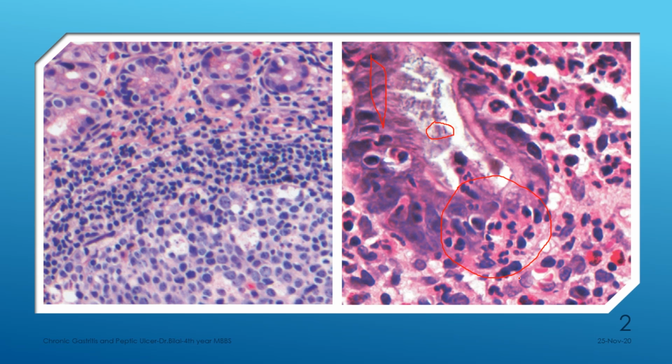You can see neutrophils, the polymorphs, you can see few lymphocytes as well. In this area you can see some eosinophils as well. So inflammatory cells in this photomicrograph are seen invading into the surface epithelium. Few organisms are visible. This is the normal lining, and in this photomicrograph, you can see a very prominent component of the chronic part of inflammation, that is the lymphocytes.